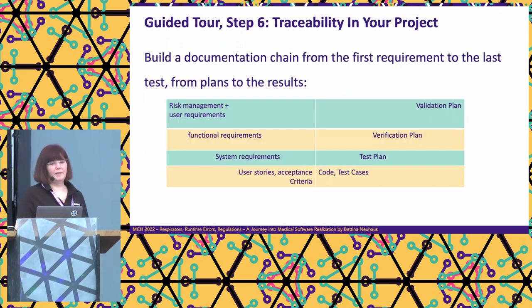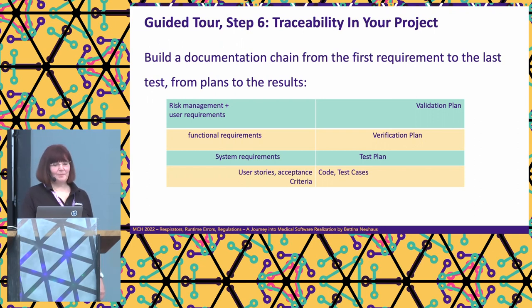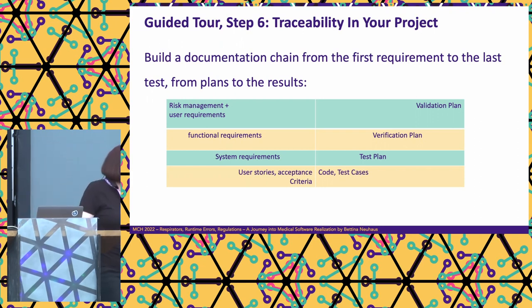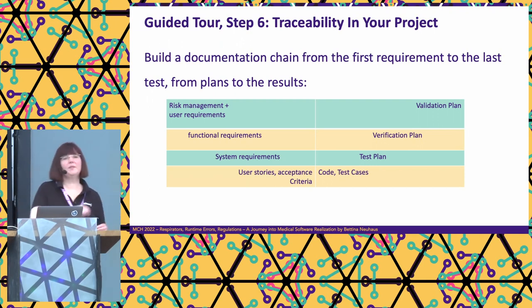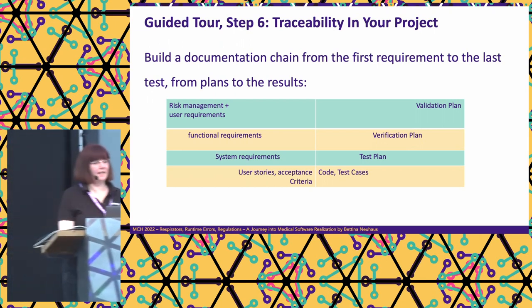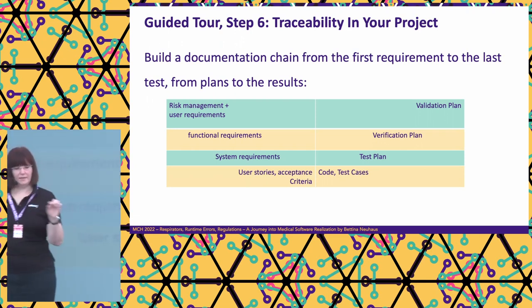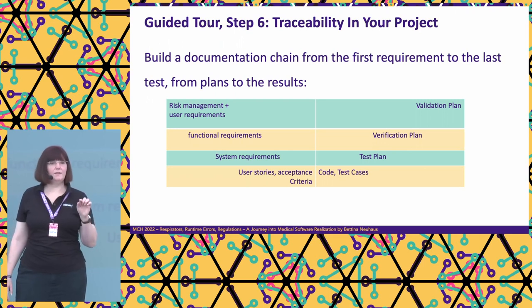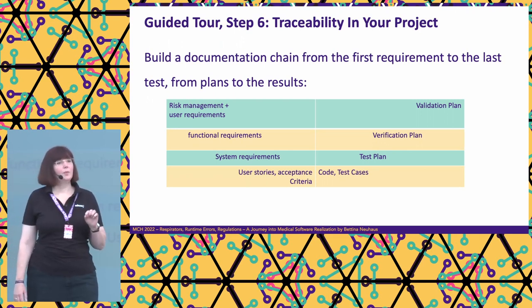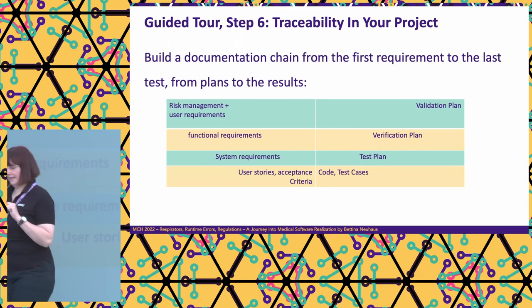Software, mainly software, but also hardware traceability in your project. The classical thing is to do a V-model planning here. Hello, project managers. Which basically means that from the very first planning up to the last, you have to show where all the requirements are. So looking at, for example, software code, there is a line of code somewhere, it's audited, you have to show why this line of code is there. Where is the requirement because of which this line of code was written?